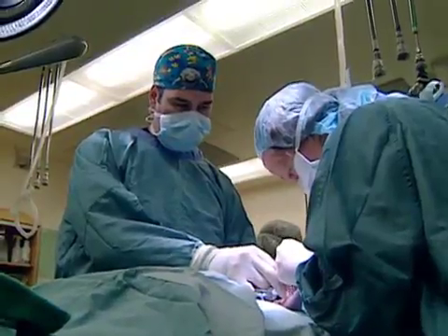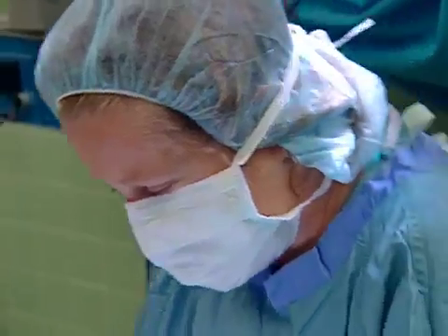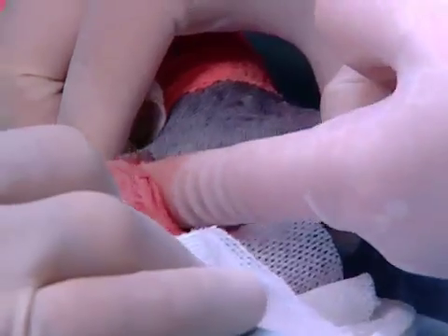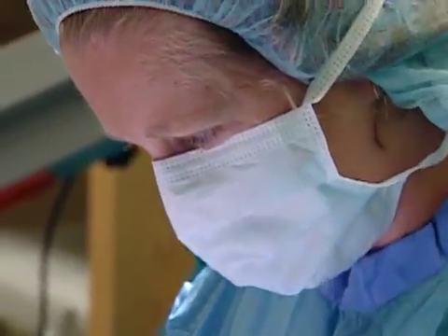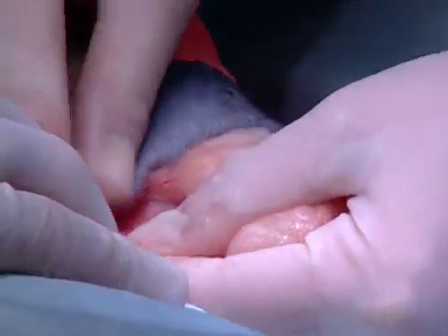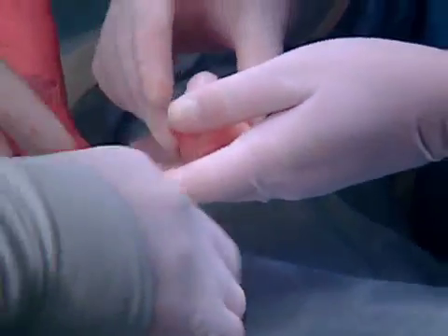Feel any nice big throbbing blood vessels or anything else that we may worry about? Student Emma Agg is removing a mass from Wojo, the poodle. It's the first time she's performed this type of surgery. Yep, that's it. We already got her up there. Yep, just keep going there. That's it. Good. All right.